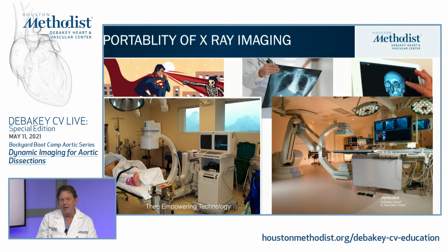But that portable C-arm, I think, was what allowed vascular surgeons to get into the habit of saying, when we went to get a job, and I always tell fellows, do not take a job where you're not going to be given a full-blown hybrid room. I always laugh because when it came to capital budget time, they'd come and say, Dr. Lumsden, what do you want for capital budget this year?